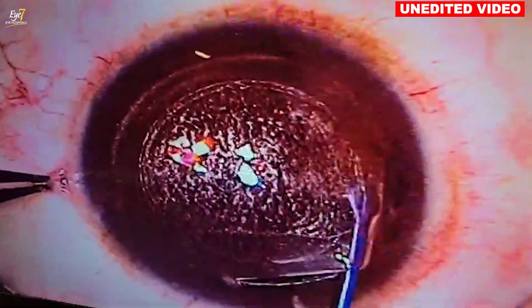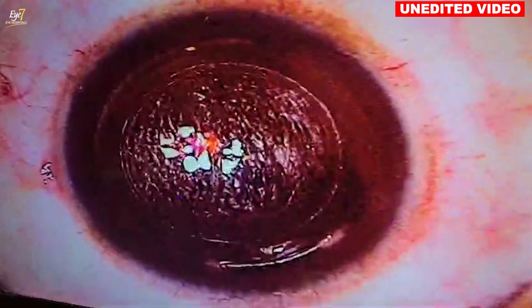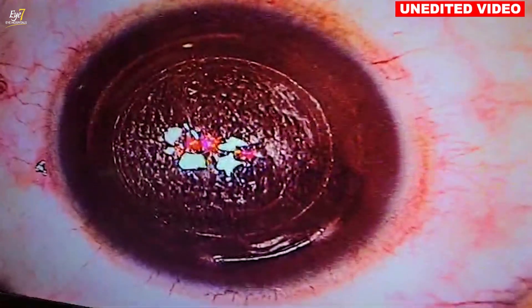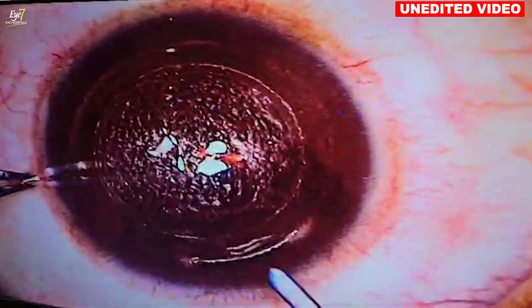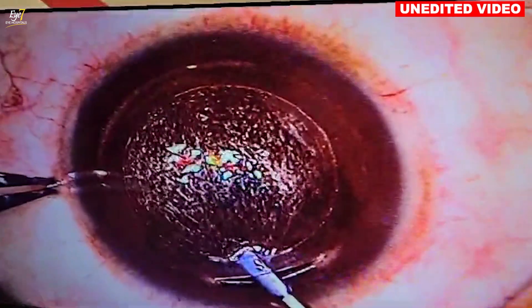Posterior plane done. You have little adhesions at the 3 o'clock and 9 o'clock positions which keep the lenticule centered. Go inside, grab it, and just pull it out.